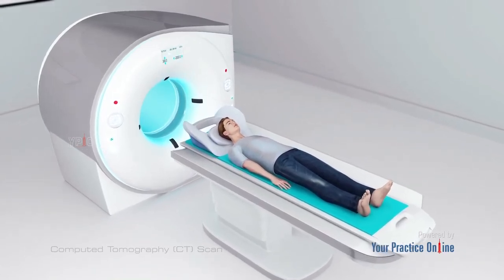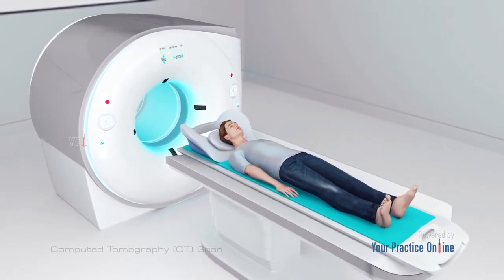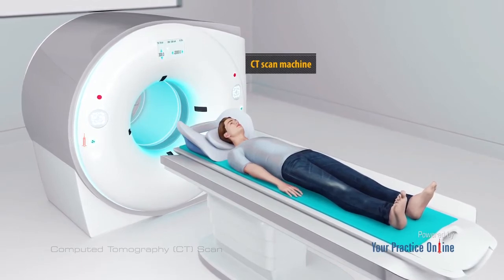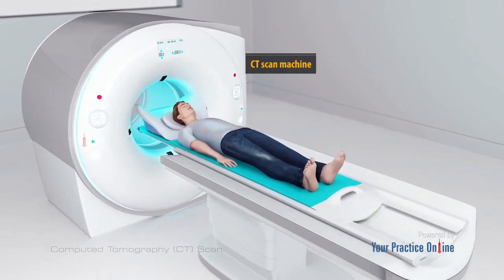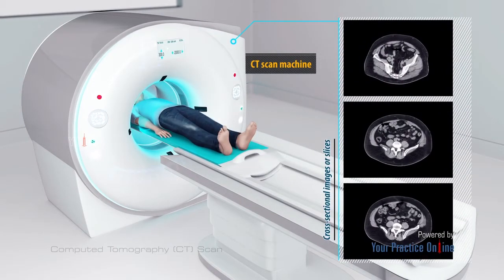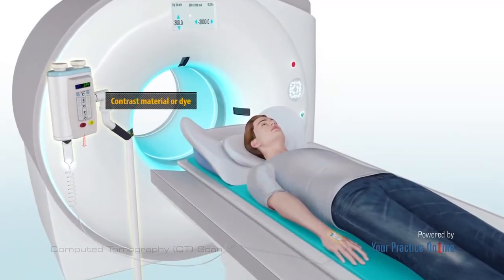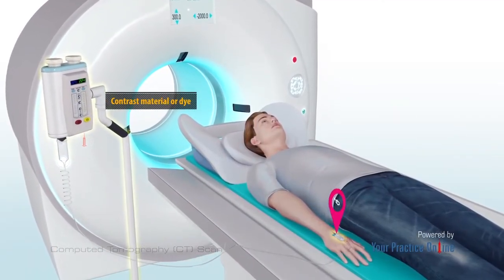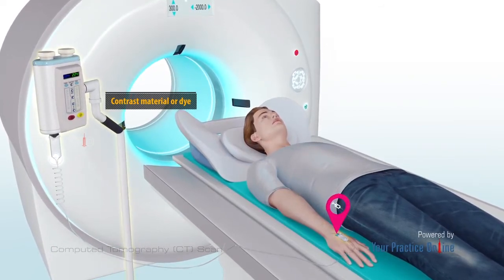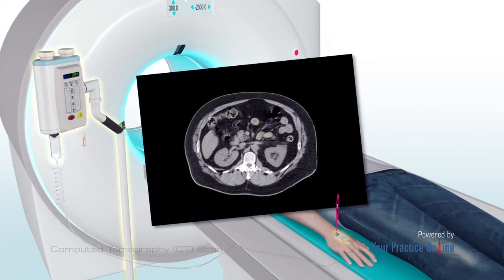Computerized Tomography, or Computer Axial Tomography, is an imaging procedure that uses an x-ray machine connected to a computer. The scan creates cross-sectional images or slices of the internal structures of the body. Sometimes a contrast material or dye may be injected into your arm or another part of your body for a better view of a particular area. The internal structures are easily visible on the CT scan with the help of the dye.